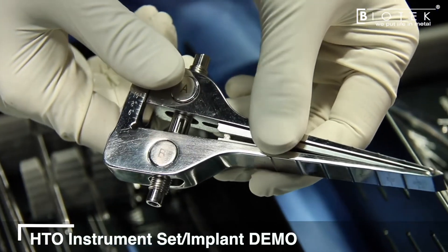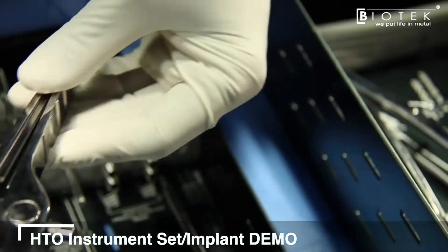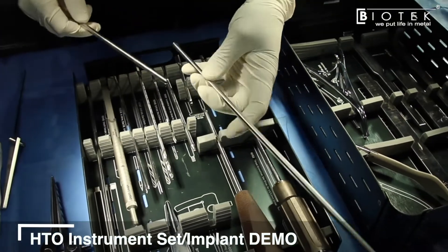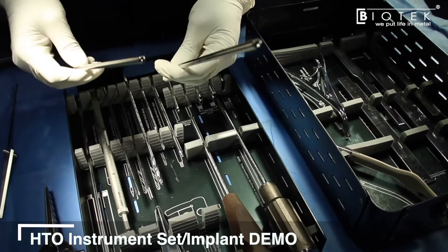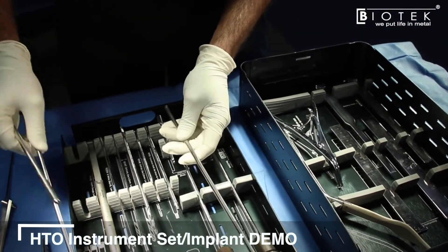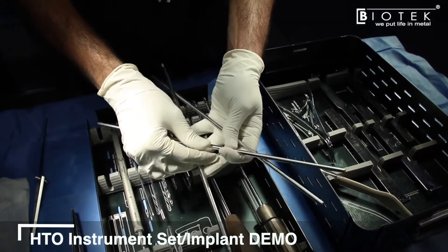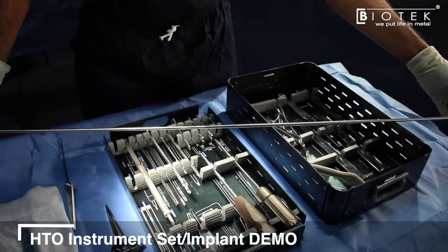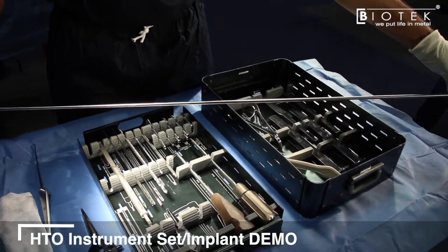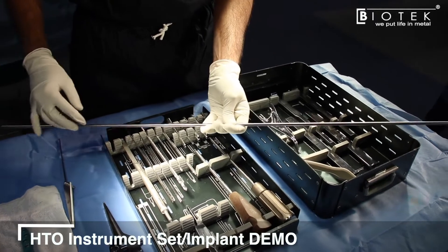To verify that the opening corresponds with preoperative planning, alignment rods are provided that thread into each other to one meter in total length, allowing you to check alignment from the hip to the knee to the ankle.